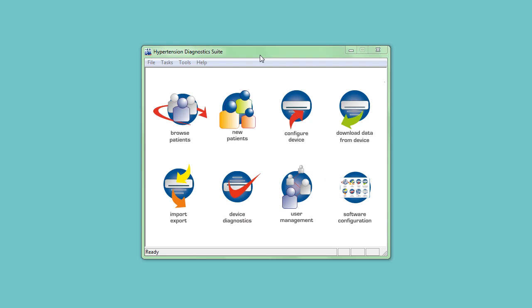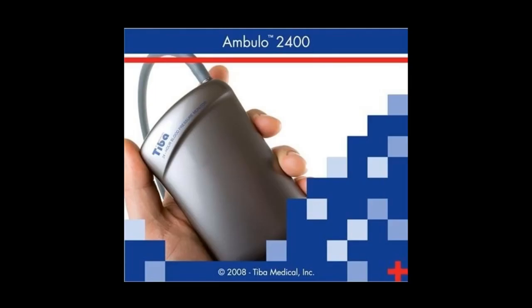Congratulations! You now know how to download measurements from the Ambulo 2400 ABPM system, analyze them, and generate a report.